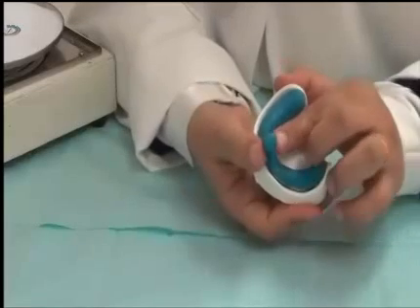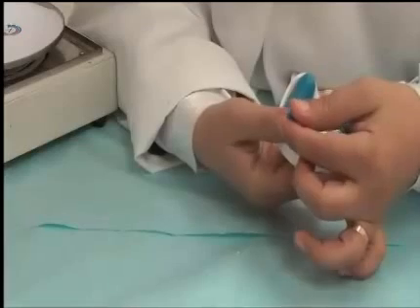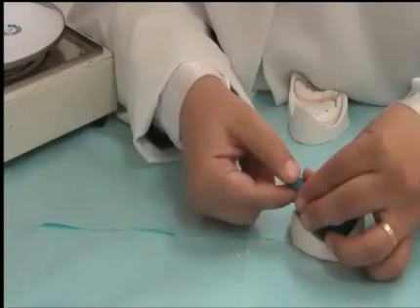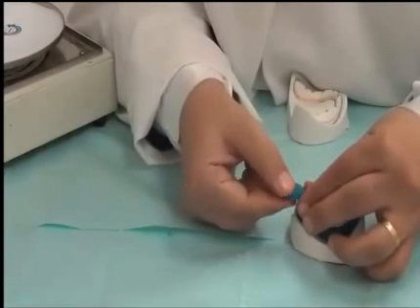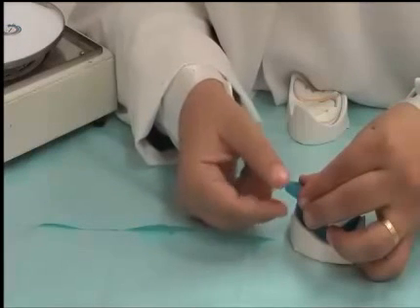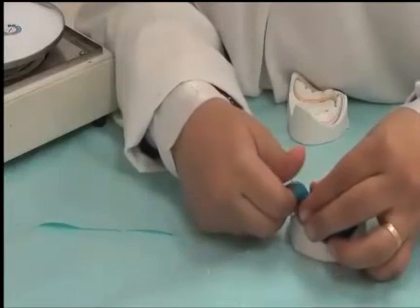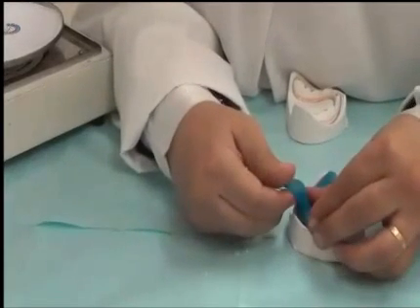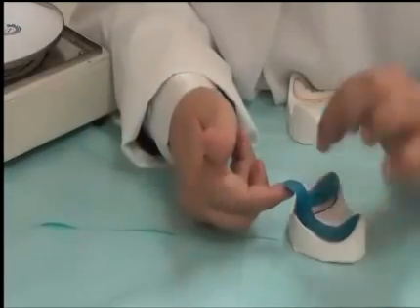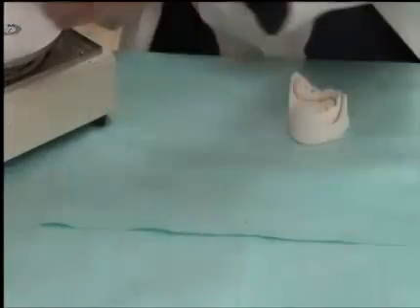We're placing our finger to mimic the lip, and then we go over that distance. So we have preserved the lip length, and over that distance we have bent the handle, and then we flatten it into this shape, so that the dentist will have a good grip over this area. So once more, if I leave it, it will slump down. I don't want to cure it while it's still up, so once more, I begin my curing with a material with supports.